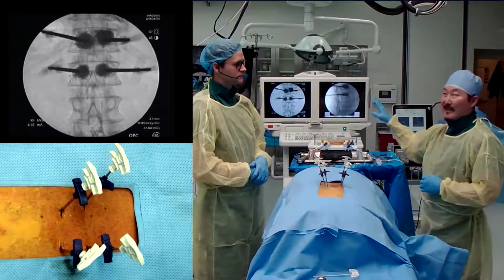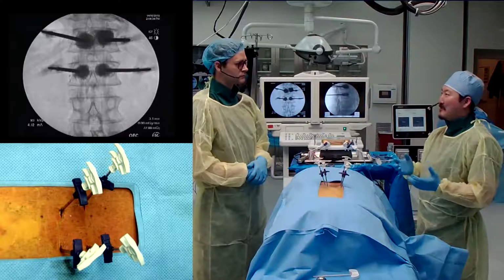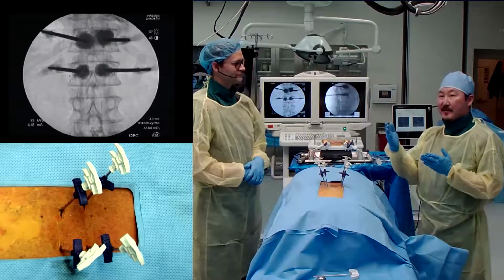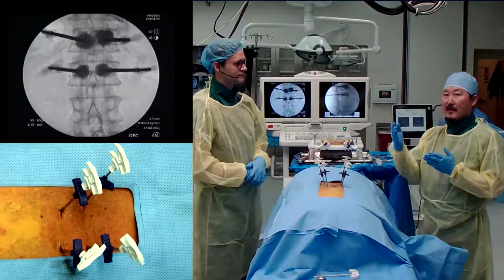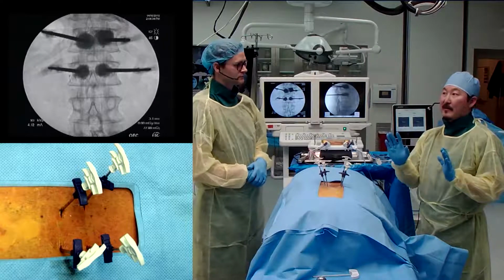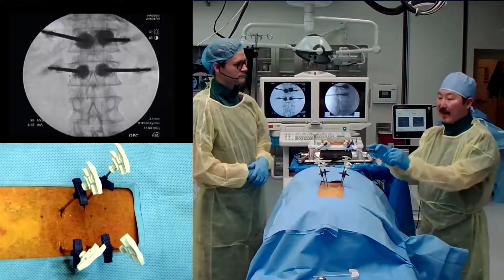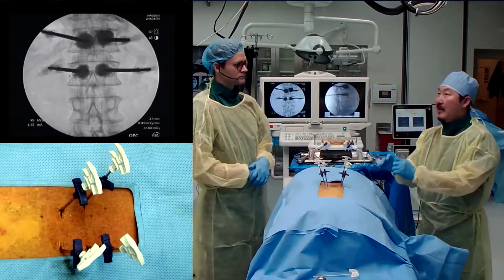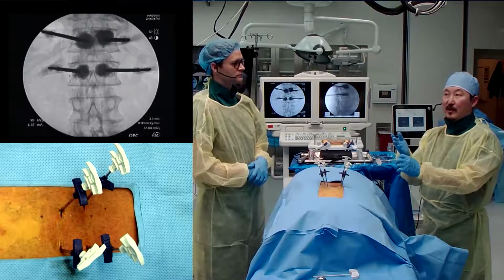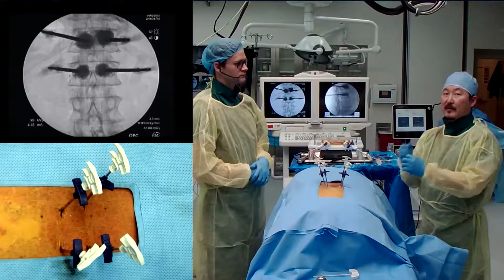I wouldn't let it get to that point because I'm much more anal retentive during the case. So if I see even just a little hint of dye going into the posterior canal, I stop everything. What we would have done in a real patient is advance that trochar more anteriorly and then continue to fill there, making sure we get enough images to ensure that it's not continuing to go into the canal.